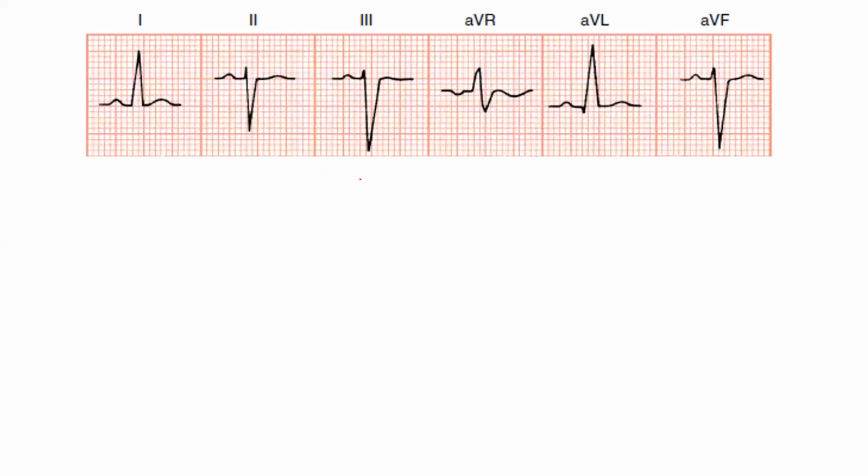-30, 75, yeah, -75 to +75. Yeah, 270, you can take it as -90, but always mention it, whatever it is, okay? Somebody said +75. +75 means down like this, okay? Convention wise, this is +75. If you go like this, it is -75.